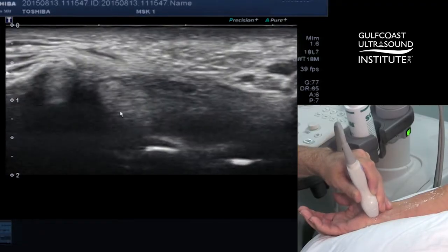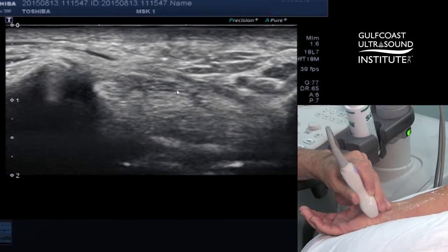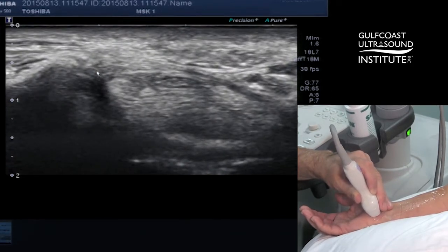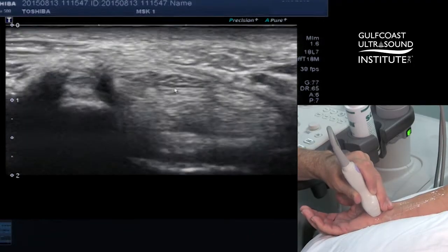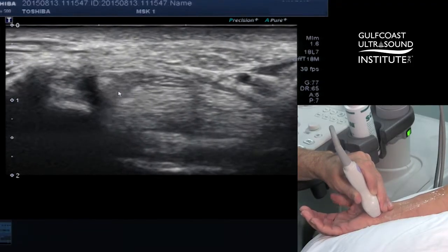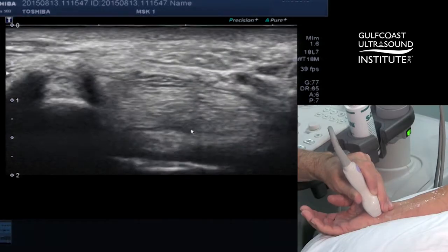So this is called the carpal tunnel outlet, and this is the area where the median nerve is generally most entrapped. So we can see this thicker transverse carpal ligament at the carpal tunnel outlet. This is the trapezium and the bony landmark of that, and the surrounding flexor tendons. Lori, can you flex your tendons for me? And so this is the flexor pollicis longus, flexor digitorum superficialis tendons, and profundus tendons.